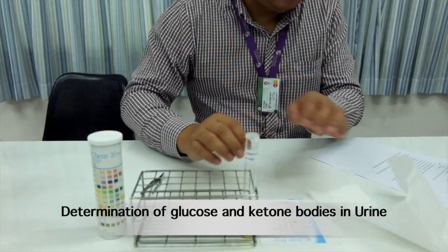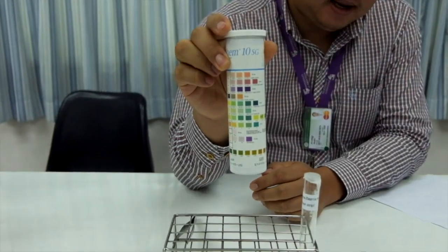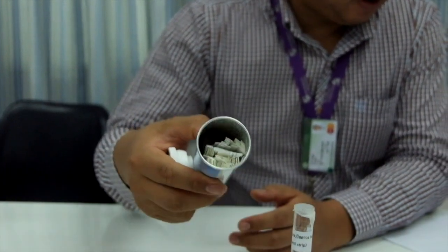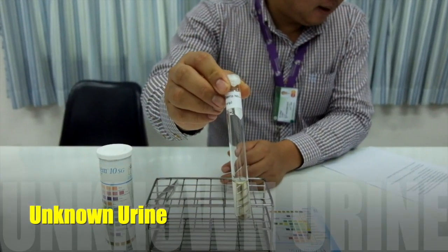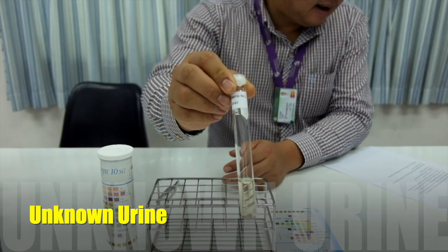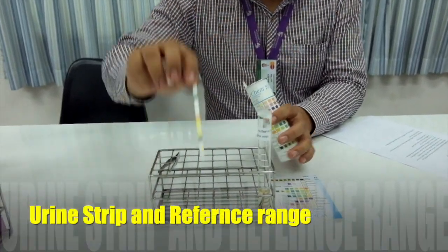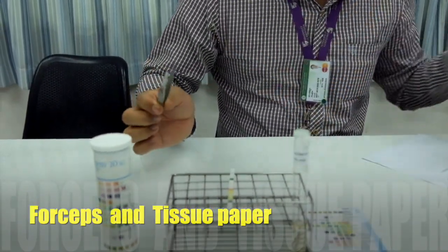Glucose and ketone bodies determination in urine. To simplify the determination of glucose and ketone body levels in urine, a commercial urine strip is used. You receive a test tube containing unknown urine collected from the same individual from the tests aforementioned, a ready-to-use urine strip, a reference range of the strip's results, forceps, and tissue paper.